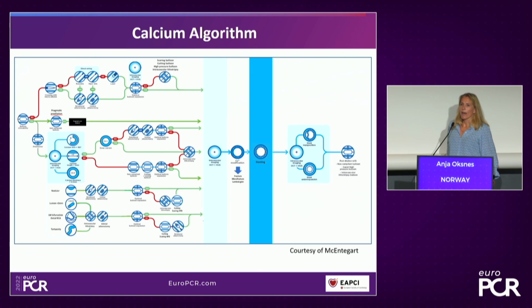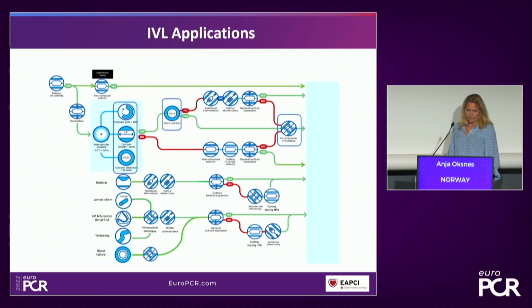Okay, so IVL has been delivered now in most countries, and this is the modified calcium algorithm by the UK group, courtesy of McEntegart.